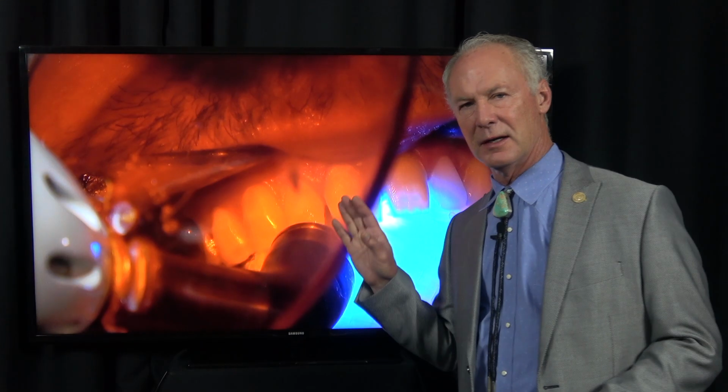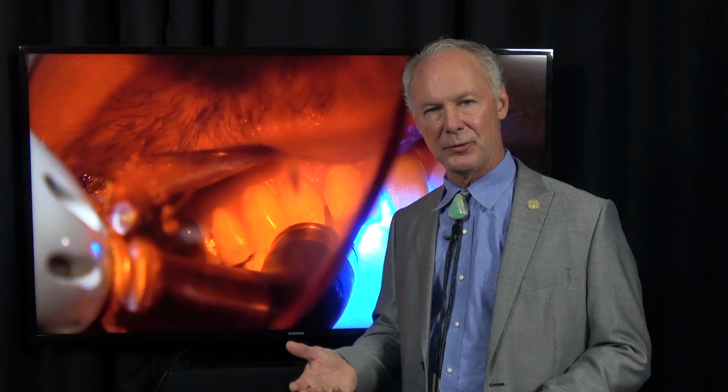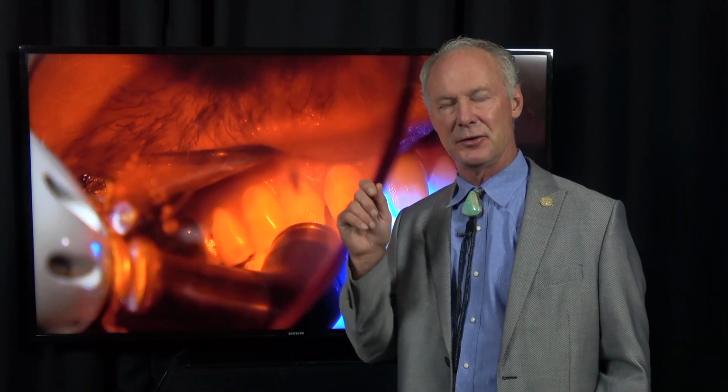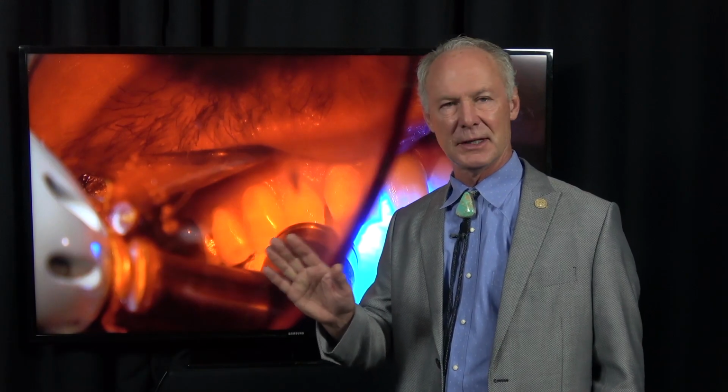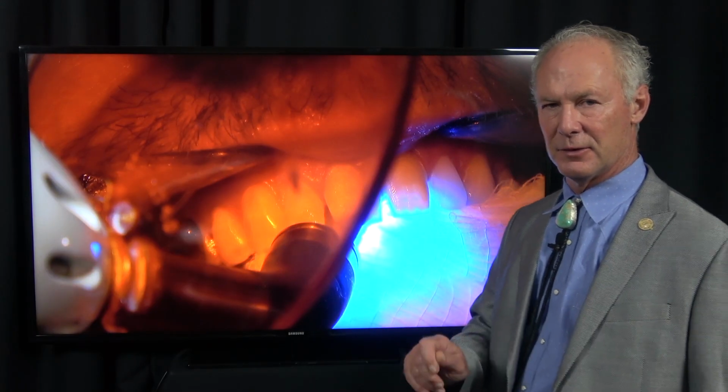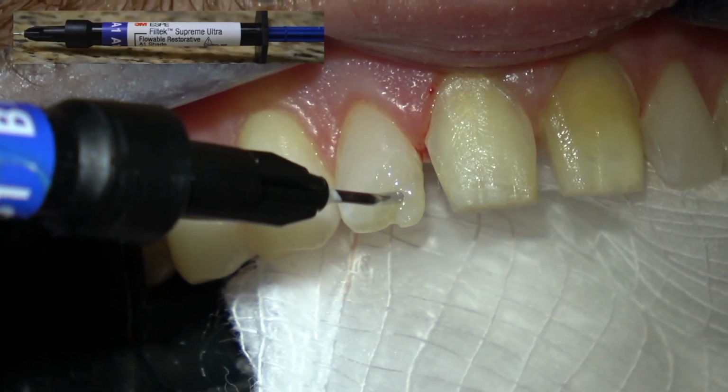Then if it's a direct composite, always cure the primer adhesive before you place the filled resin. If it's a class 1, 2, 3, whatever it is, if it's a direct composite, always blow off the primer adhesive and cure it before you place the filled resin. If you'll do that, you will virtually eliminate sensitivity. Now don't do it if you're placing veneers, but if it's a direct composite, always cure the primer adhesive after you've blown it off before you place the filled resin. And you only have to cure it for about 5 seconds.